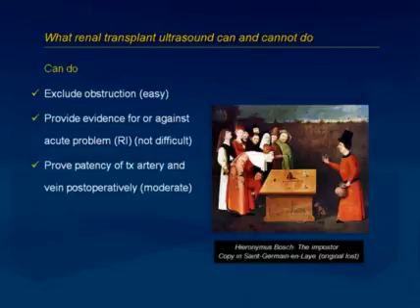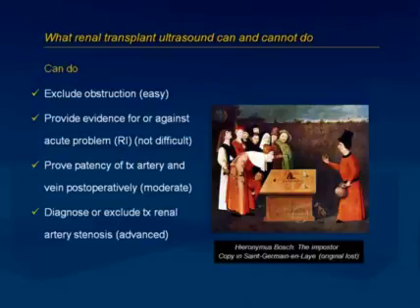We can also prove patency of the transplant artery and vein post-operatively. That is actually very important in an acute transplant unit. So if you work in an acute transplant unit, then you will know how important it is to know that the transplant artery and vein are patent if, for example, a transplant deteriorates in the first 24 hours after surgery. What we can also do is diagnose or exclude transplant renal artery stenosis, although I think it's fair to call that advanced, and that needs a fair bit of experience and supervision, and that is for the advanced ultrasound wizard.